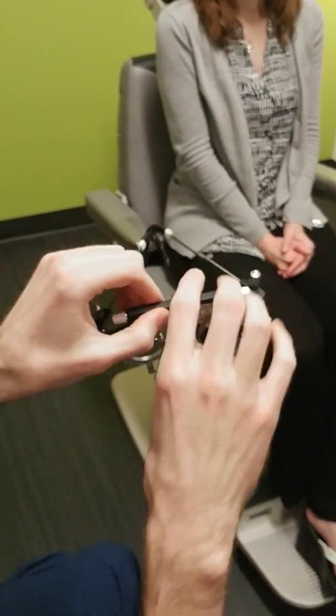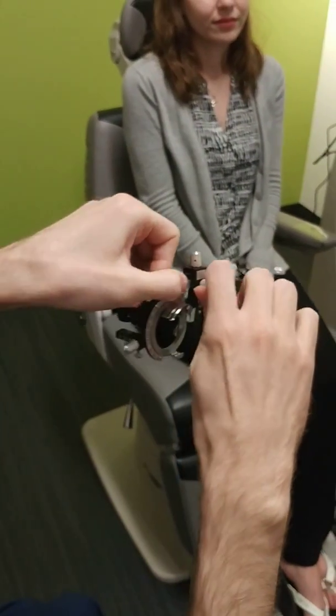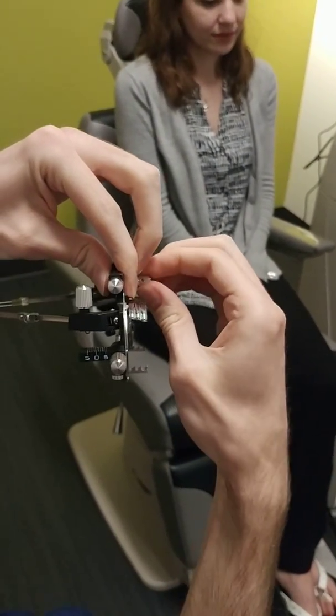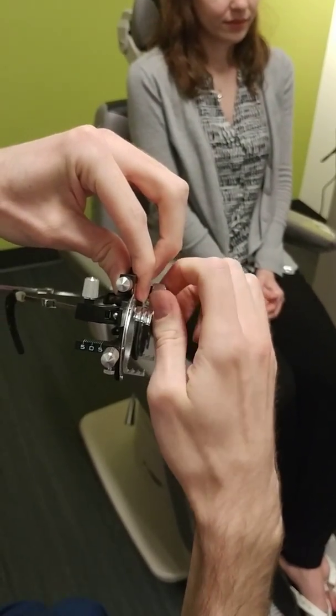The first one I'm going to talk about — because it's not used too much — is actually the vertex distance. It's this middle one here. If you look from the back, you can see that it's moving the nose pad forward and backward. You can use that if you feel like your trial frame is too close or too far away from someone.